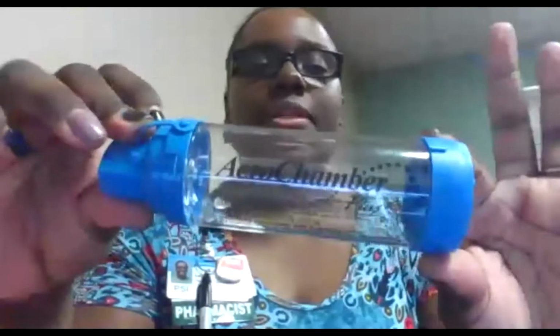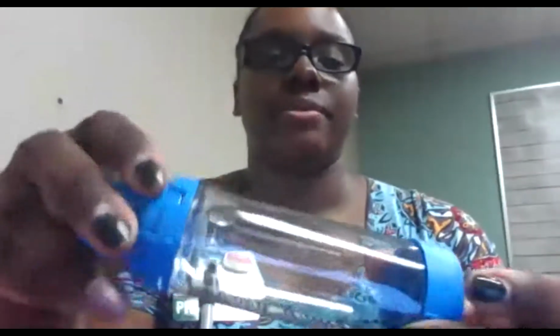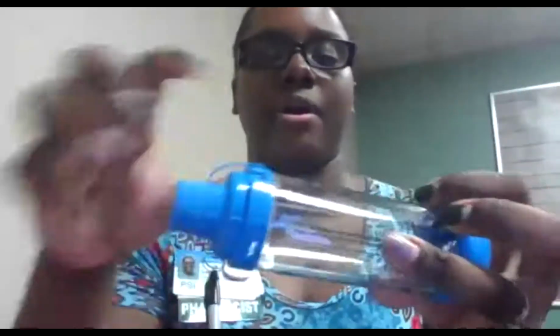So those are the most common types of inhalers. There are certainly a couple of other ones. Oh, actually, some of you might have something called an aero chamber. This is what that looks like. There are other brands, but this is typically the one that I see. This aero chamber just makes it easier for you to get your dose of medication, because not everyone has the same suction power as others. Their lungs might need a little bit more help. And this you can only really use with the puffer.